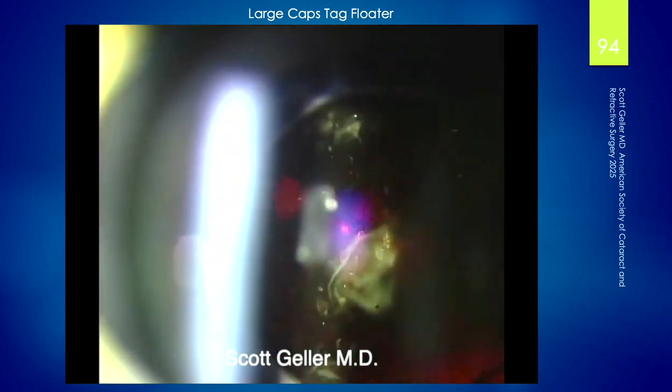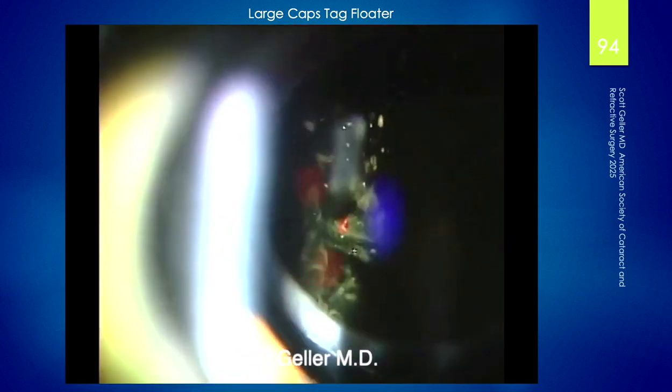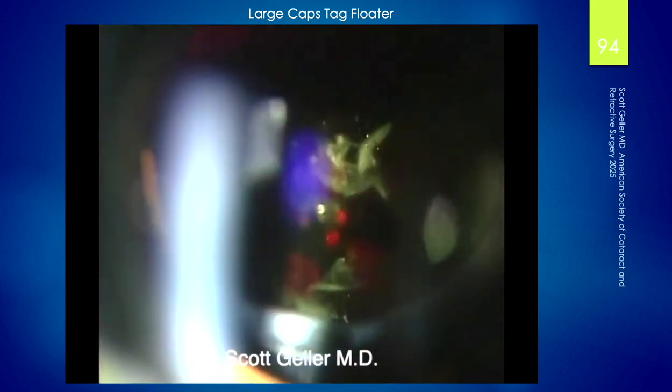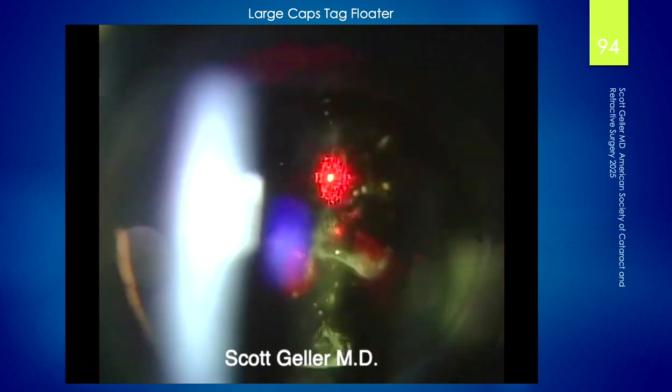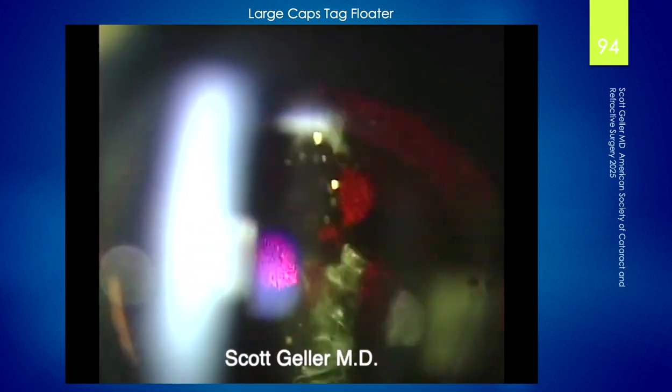This is another interesting case, a happy patient, but I have a hard time getting that out of the visual axis there. But you did. Might have taken 70, 80, who knows, maybe 90 pulses, I don't know. Those are all single shots. There we go. Come on, floater, be gone.